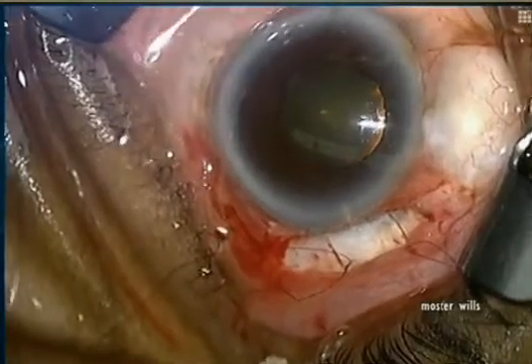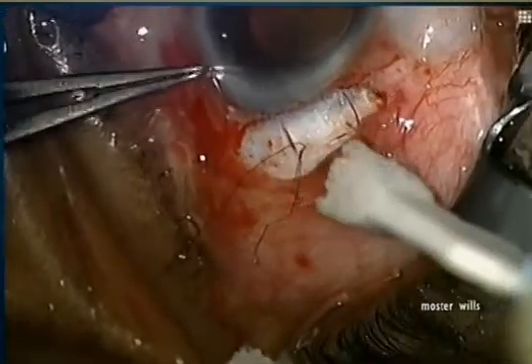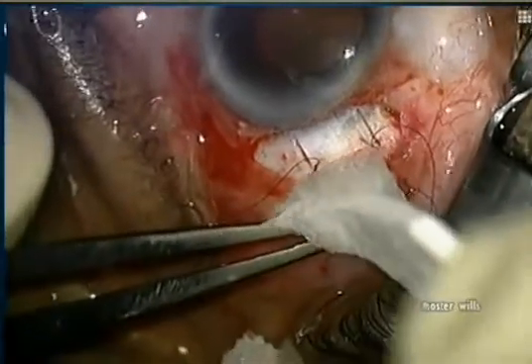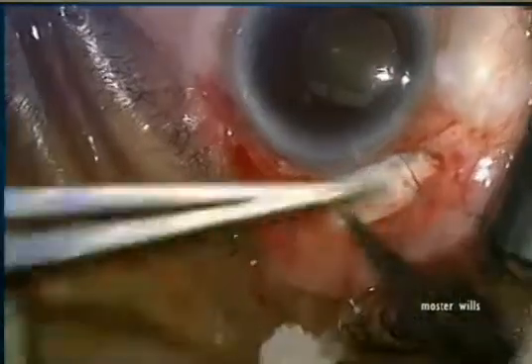Now you have to decide just how much flow you want. We refill the anterior chamber and put slip knots on the 10-0 nylon to decide how much flow we want. Ideally I want flow out the posterior edge of my flap, and I want to make sure this occurs when the pressure hits about 15 millimeters of mercury.